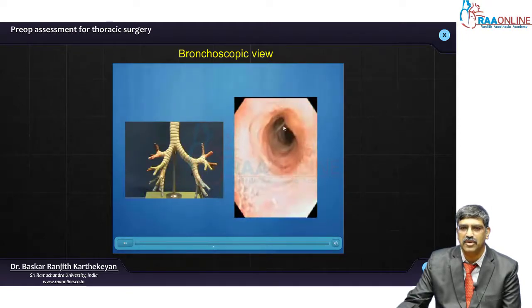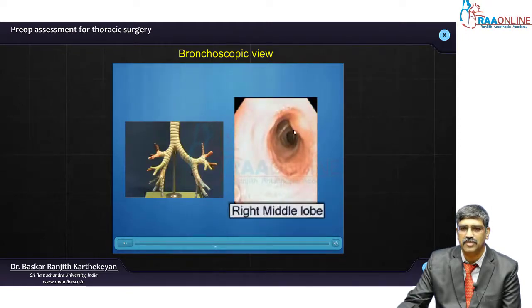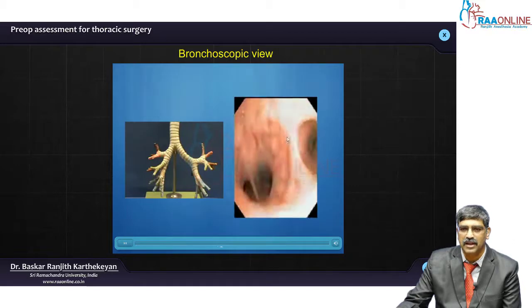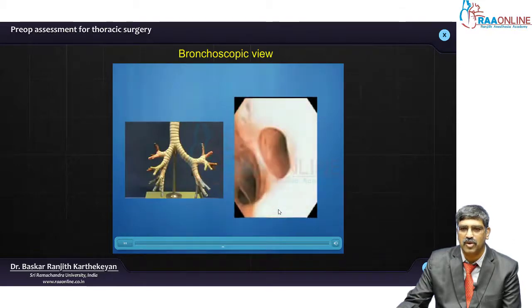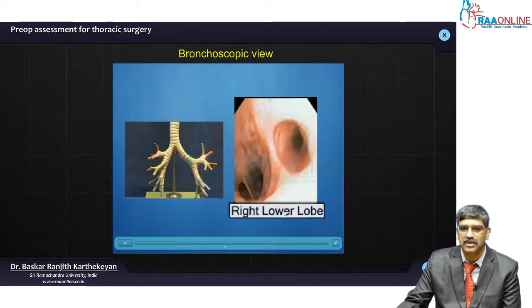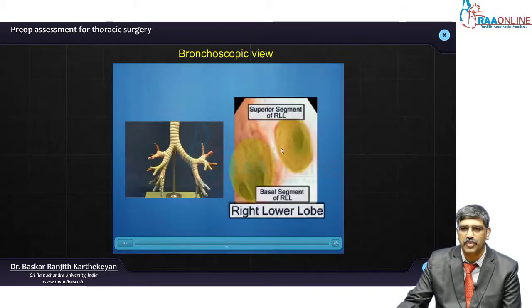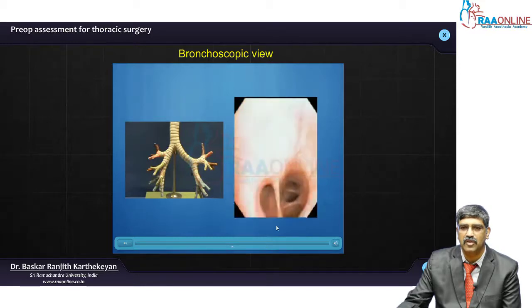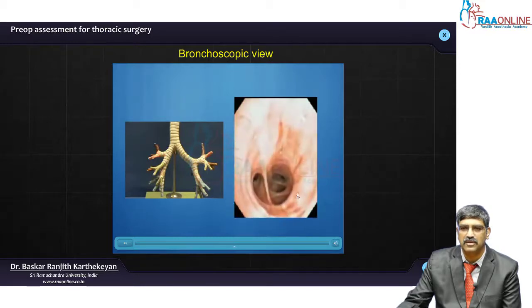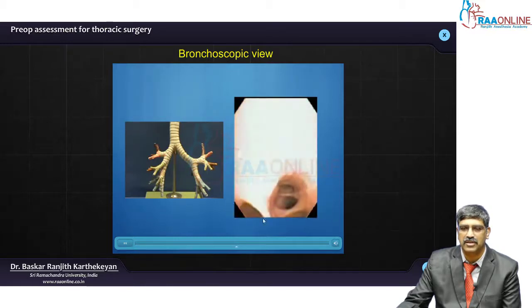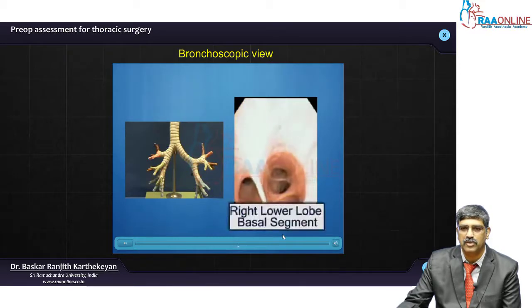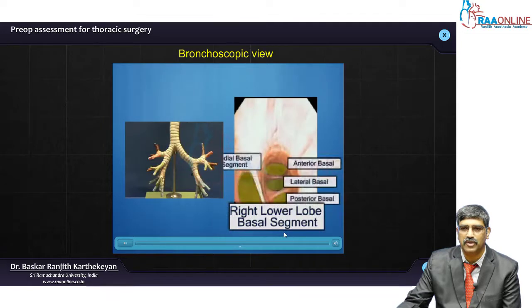As you enter the middle lobe, you can see 2 sub-segments. And as you enter into the lower lobe, you can see the superior segment and the basal segment. The basal segment again has 4 segments — here you can see 4 segments coming into it.